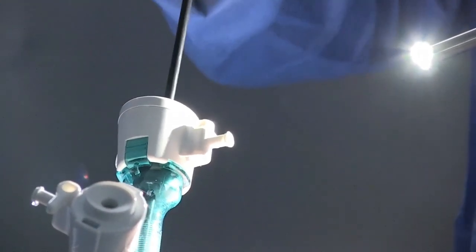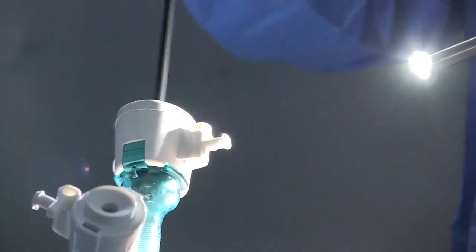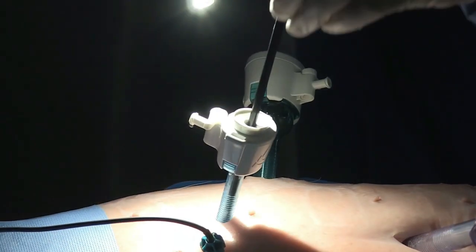Gas leaks through instrument ports are common and even have a characteristic sound familiar to surgeons performing laparoscopic surgery.